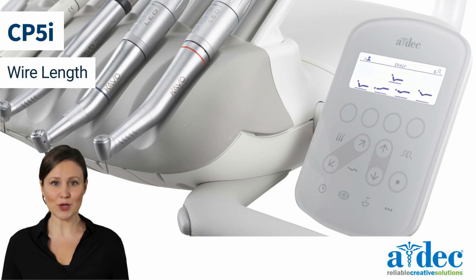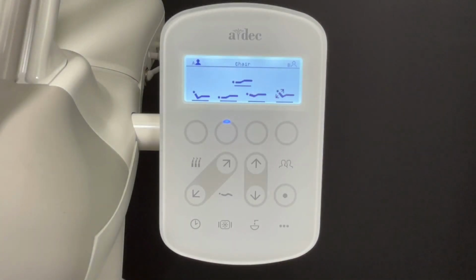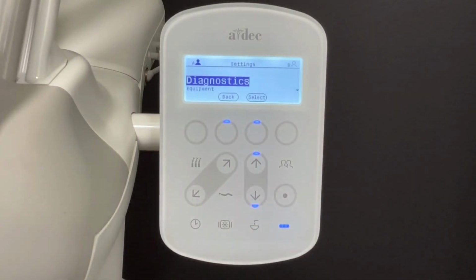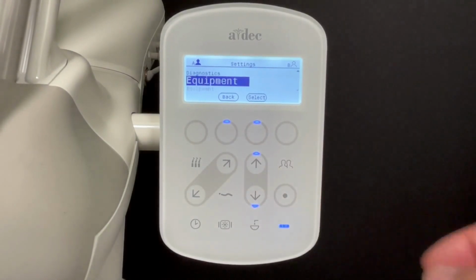In this video, we will discuss setting the handpiece wire length on a CP5i control pad. Begin by pressing the Options menu button. Then enter the Settings menu. From there, select Equipment.